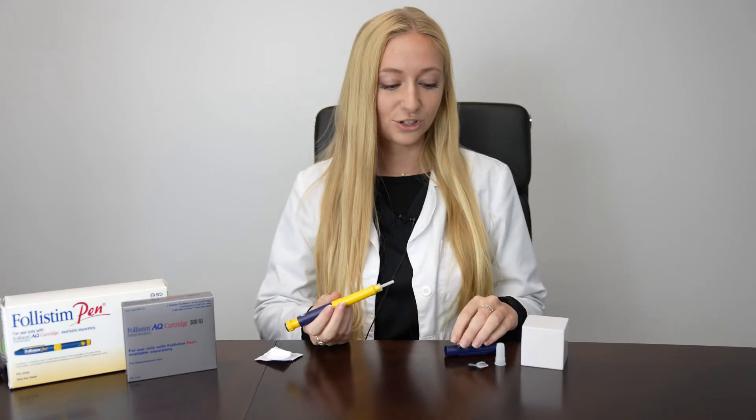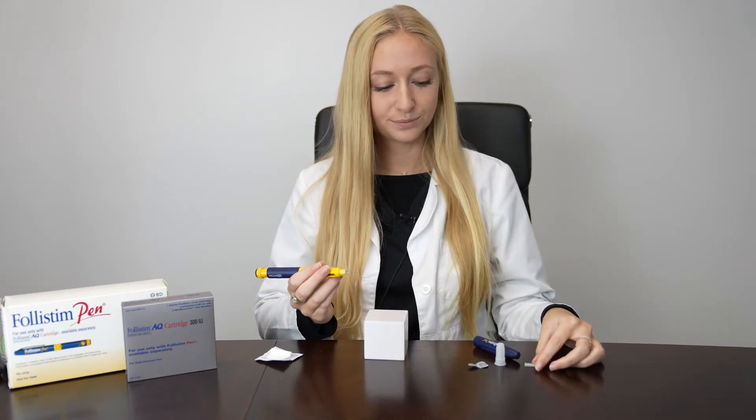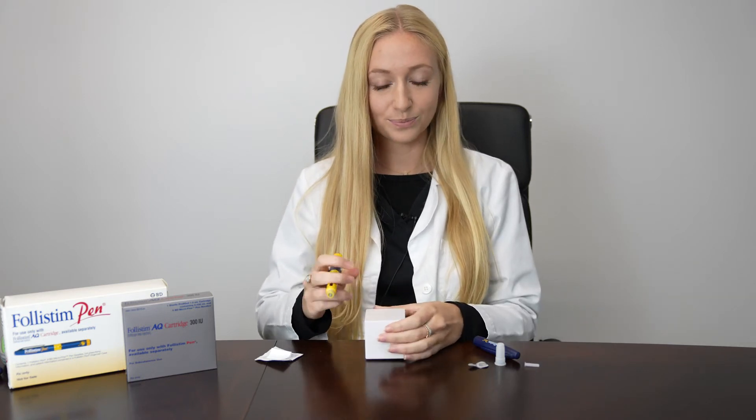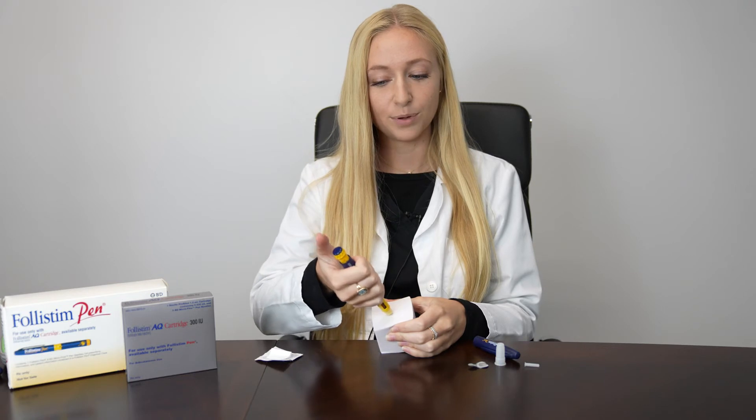This will be a subcutaneous injection in the abdomen. You can remove the plastic covering, wipe the skin with alcohol, pinch and squeeze, inject at a 45 to 90 degree angle, and push down on the pen.